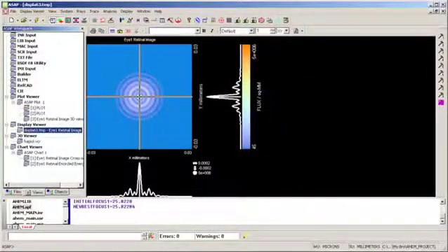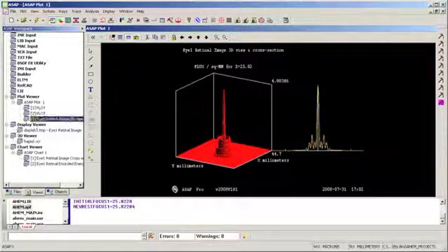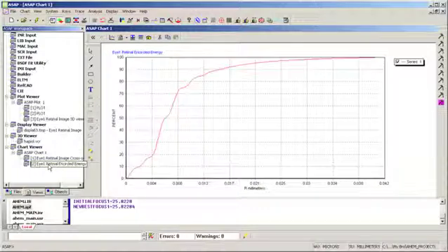All right, so my ray trace is complete, and we're looking at some graphics. I did a coherent trace through this system, so we see the coherent graphics, and there's my trace and plot. Here's my isometric plot and my cross sections and my other graph cross sections. Here's my retinal encircled energy. So this is a pretty good IOL, and much like a real eye.